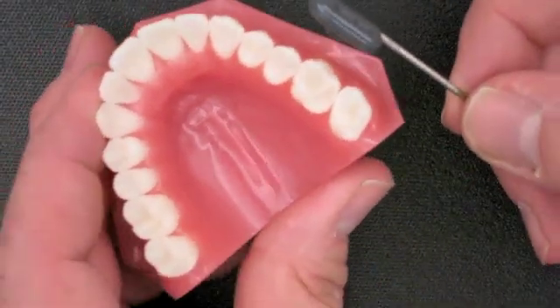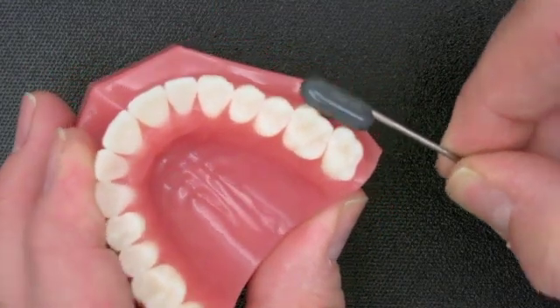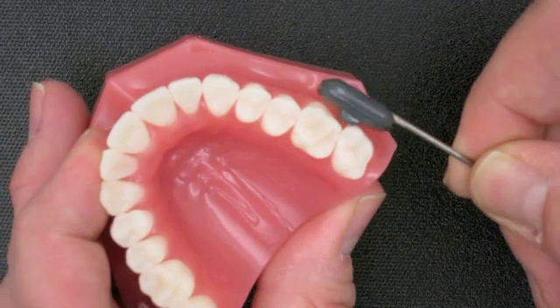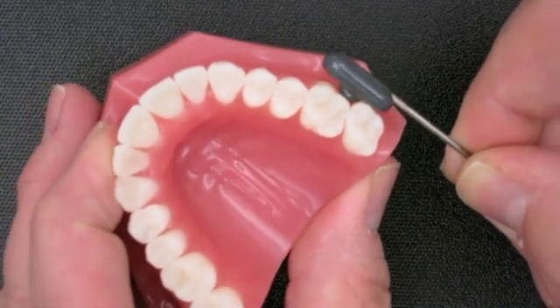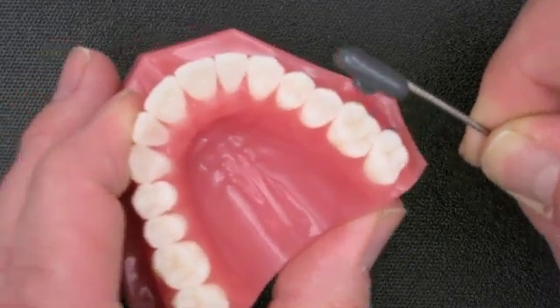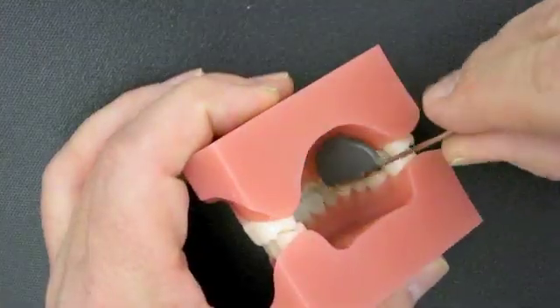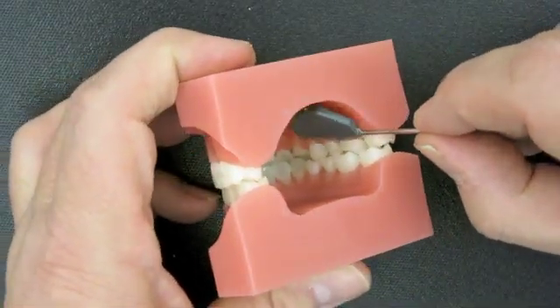Here's the actuator again being brought in. Ideally, it fits on two teeth, which could be a first and second molar, also a second and third molar. But we don't want it rotated, and you can see that we are very much dependent on the anatomy of the teeth, missing teeth, or restorations that are on the teeth. We can always bring the actuator forward, but sometimes it can be an aesthetic problem.